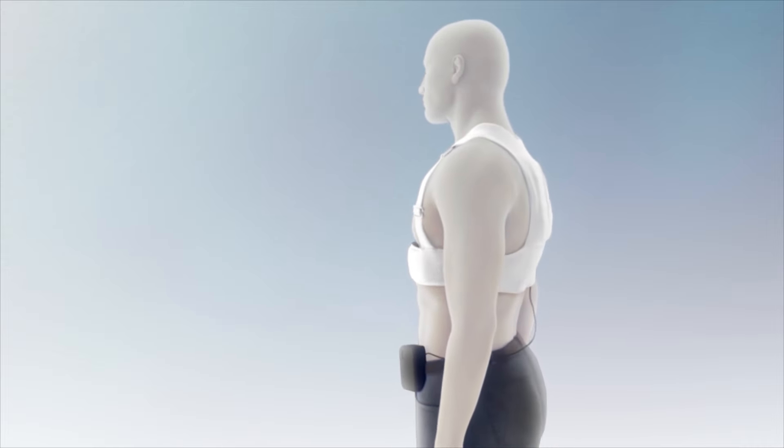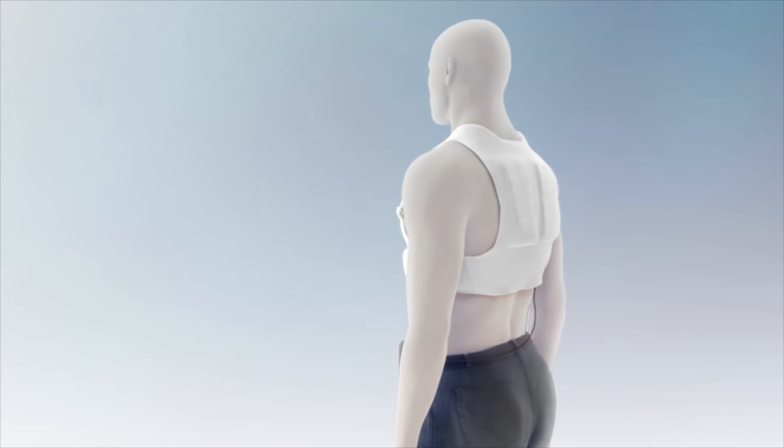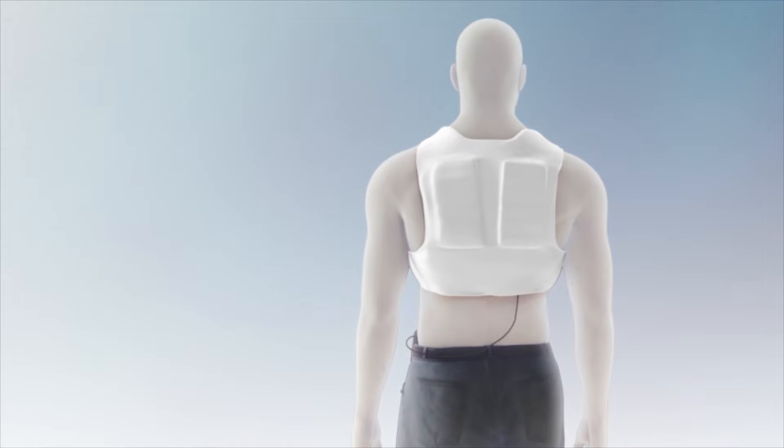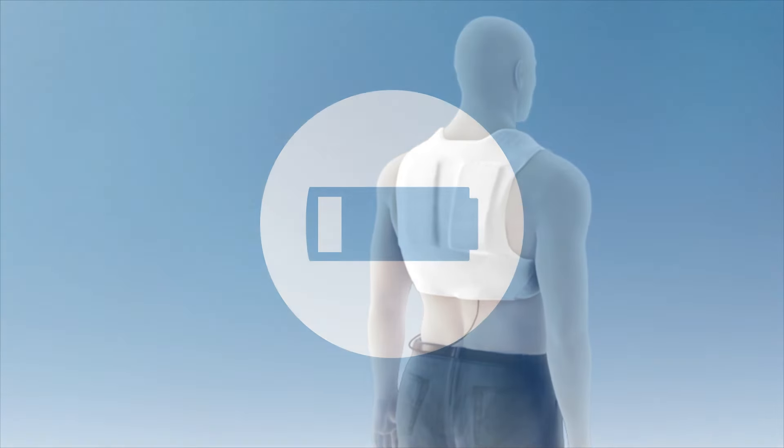Now that you have inserted a fully charged battery into the monitor and activated it, your Life Vest is ready to monitor your heart and protect you. Your Life Vest comes with two batteries. While you're using one, the other should be charging. Place the used battery into the charger and firmly push it into place. Read the battery status on the charger to ensure that the battery is being charged. Leave the battery in the charger with the charger plugged in at all times until you again need to change the Life Vest batteries.